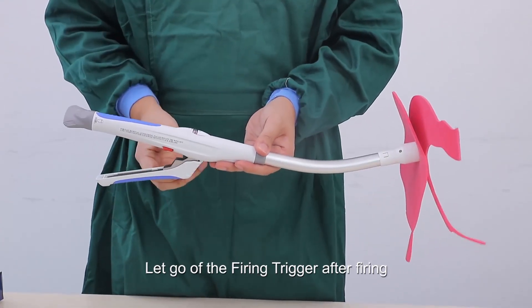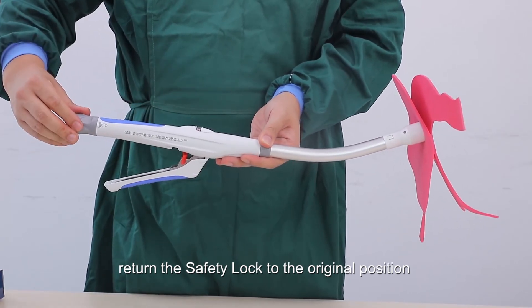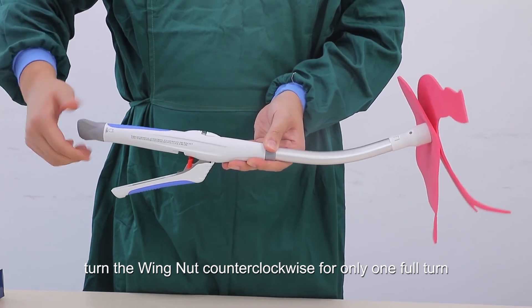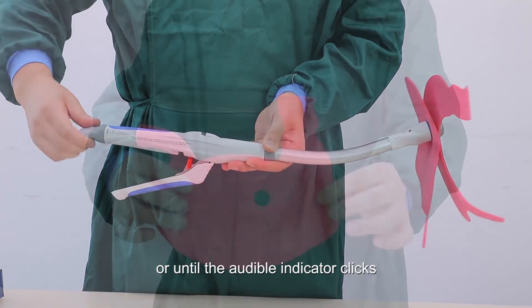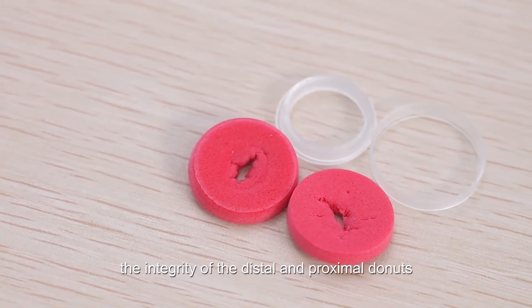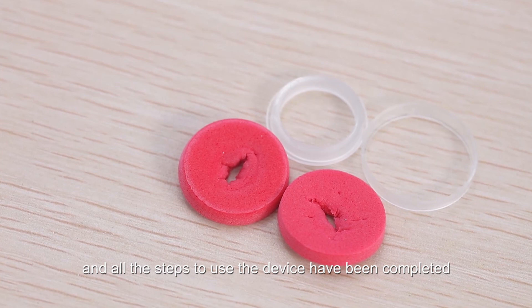After firing, release the firing trigger and return the safety lock to its original position. Turn the wing nut counter-clockwise for only one full turn or until the audible indicator clicks. After the device is completely removed, fully open it to inspect the integrity of the distal and proximal donuts. This completes all steps for using the device.